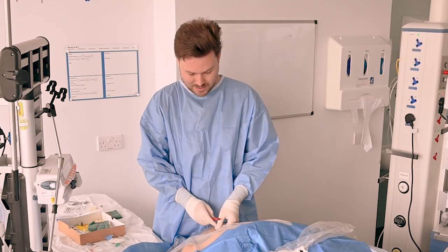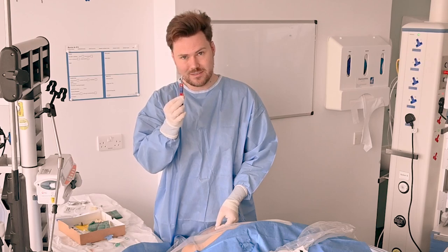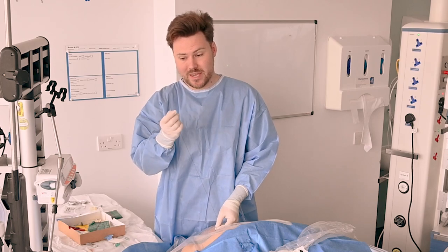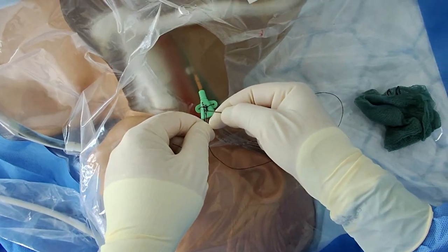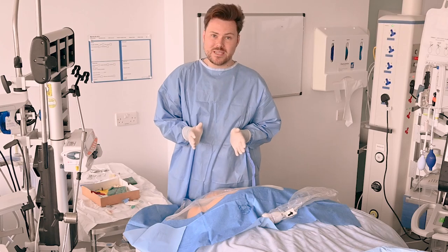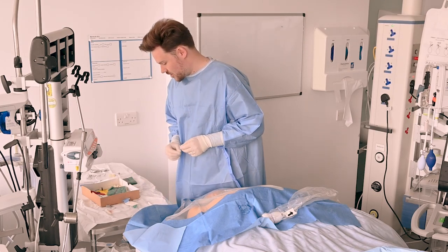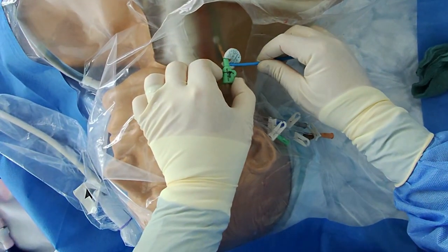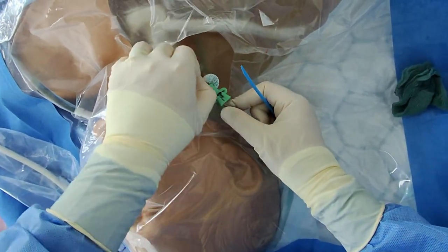With everything secured in place, it's time to cut off the excess sutures. Our kit has a scalpel blade in to make that easy, but a little tip: you can, in a pinch, use the sharp edge of a needle, cutting away from yourself. I leave about a centimetre of excess suture on top. Now it's time to insert the biopatch. I'm going to use a cover from one of the needles just to help ease it underneath, making sure that the blue side is facing away from the patient's skin.